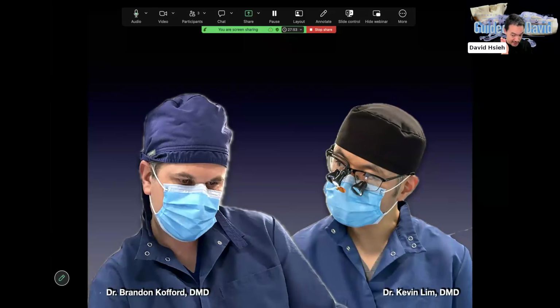I learned what their mentality is, what their treatment plan looks like, how they adjust and tweak the implant position, and then it finally comes to me to design the guide. I was able to be there to see how the surgery really goes, and to see the long-term outcome of the surgery. This is awesome. So this is basically who I am and what I'm doing right now.